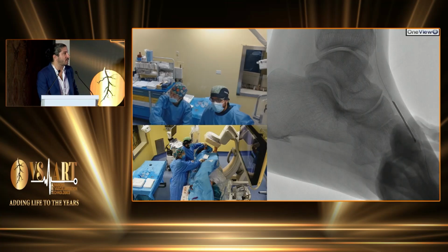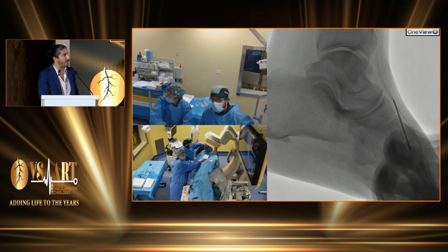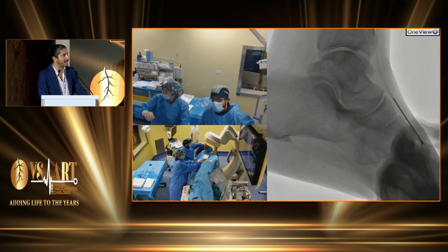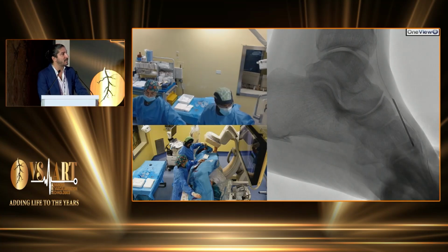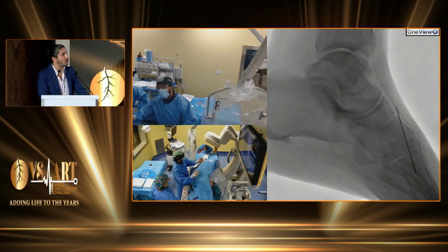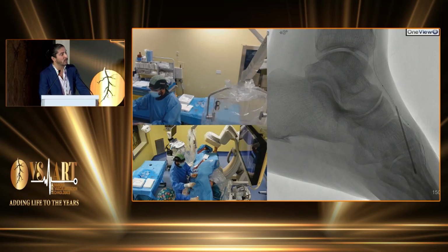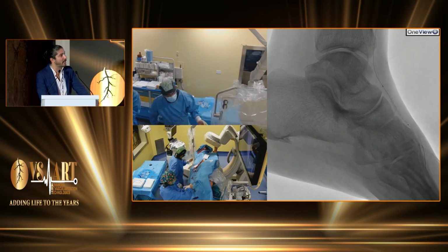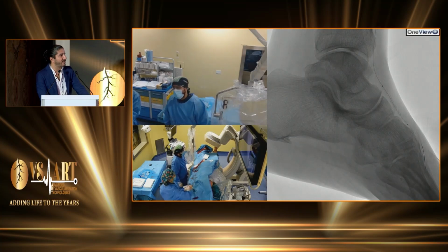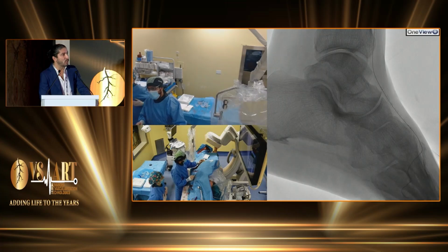So after changing the balloon multiple times, we decided to go for the Pierce technique. It means cracking the calcium by external puncture. This is a 19-gauge needle, so aggressive. And finally, the balloon was able to transit, to pass this calcified occlusion and allow us to prepare the vessel for the final treatment. So this is one of the tools we have today to fight against calcium.